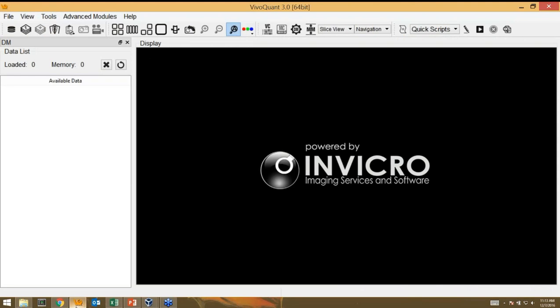So jumping into the software itself, just a quick overview. I'm going to go through essentially 3 different workflows with 3 different types of data. The first being a fairly basic workflow of loading and pre-processing data and then ultimately quantifying it in our 3D ROI tool.